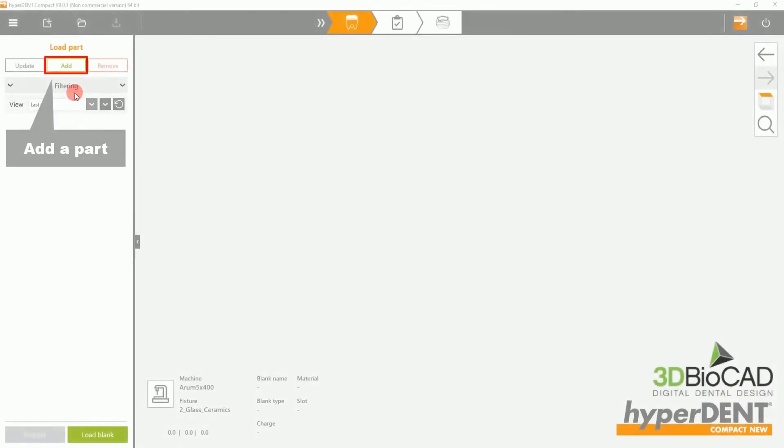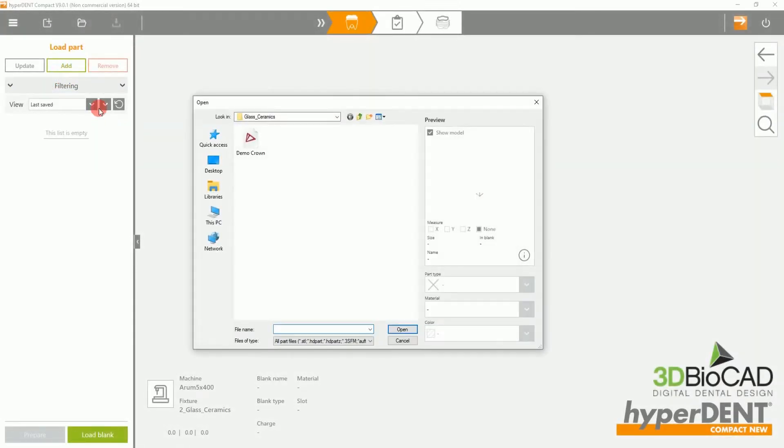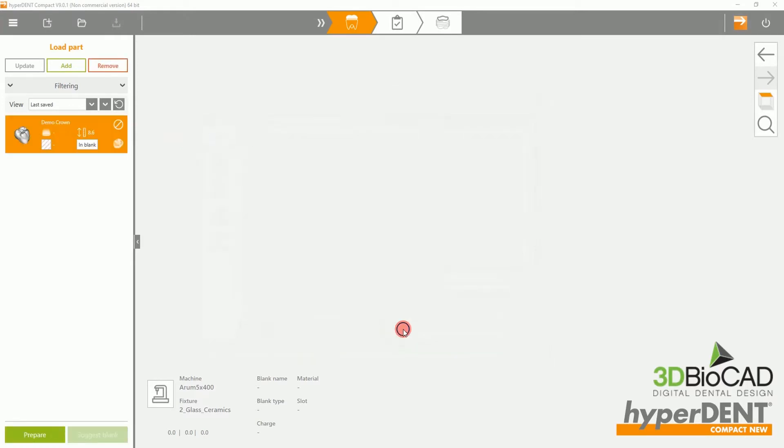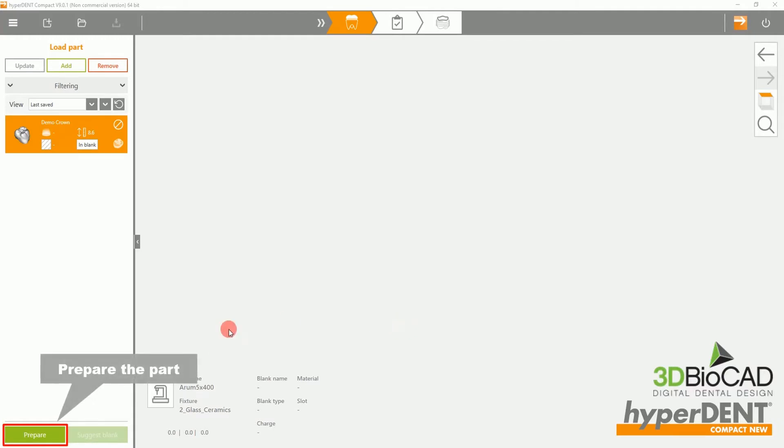To begin, please add a part. In this case, we will be using a demo crown file. Then select prepare on the bottom left of the screen.